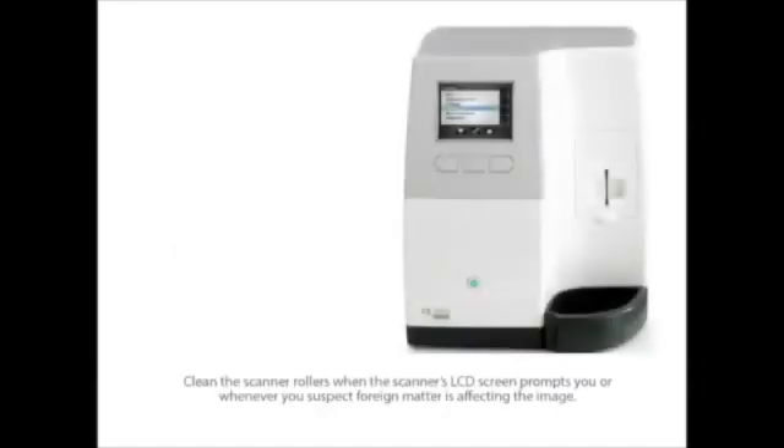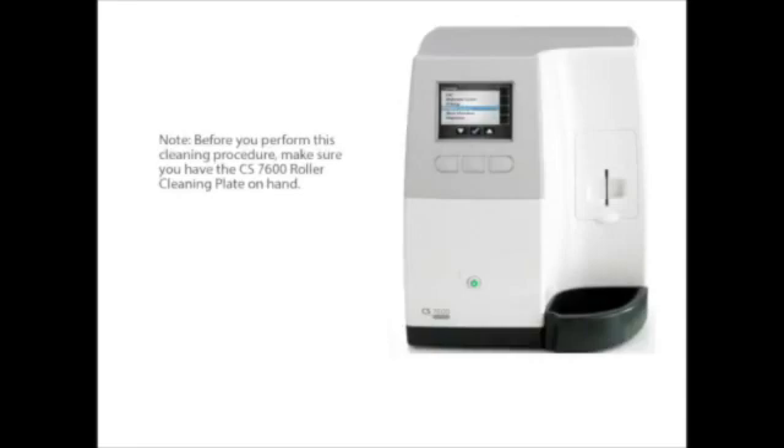The scanner rollers should be cleaned when the scanner's LCD screen prompts you, or whenever you suspect foreign matter is affecting the image. Before you perform this cleaning procedure, make sure you have the CS7600 roller cleaning plate on hand.